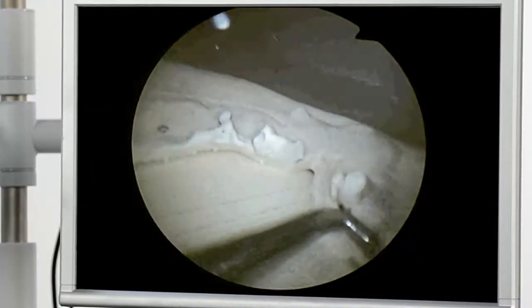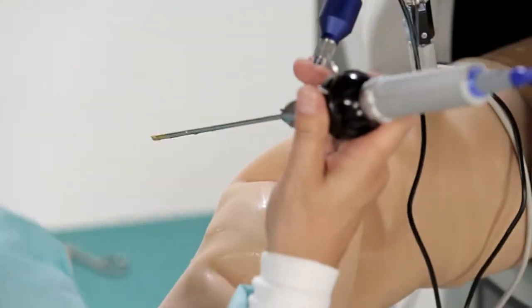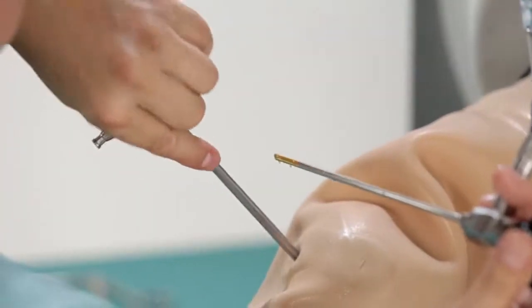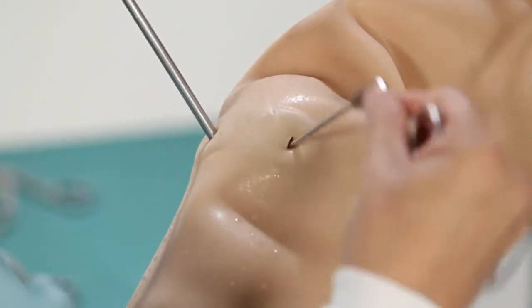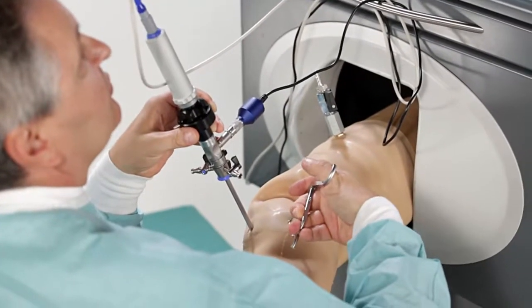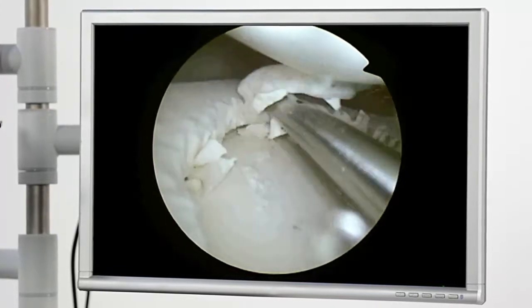The close-up here is of the posterior horn of the medial meniscus. After changing the instrument to the anteromedial portal, the simulation of the arthroscopic treatment begins, starting with medial meniscus partial resection beginning at the anterior horn into the side section.